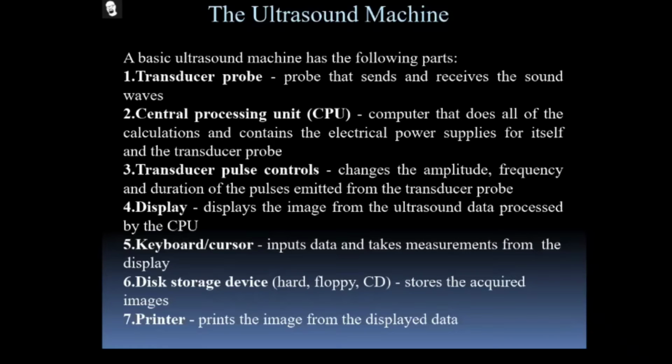Then the display, of course, the monitor, displays the image from the ultrasound data processed by the CPU. After the processing of the image, all of these things happen in a fraction of a second. When we apply the gel over the patient's body and keep the probe on the skin, within a fraction of a second the process of imaging and the reconstruction software functioning all happen.